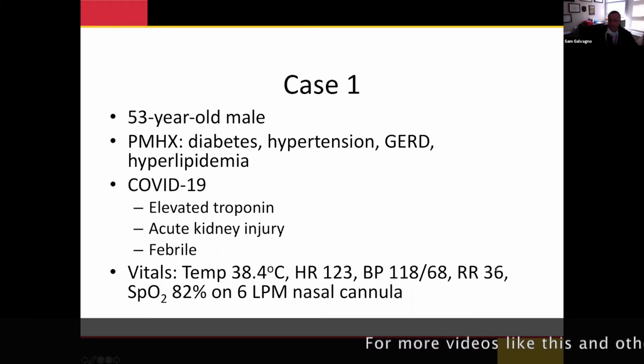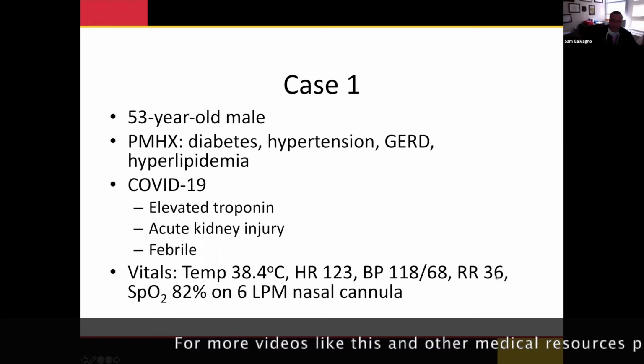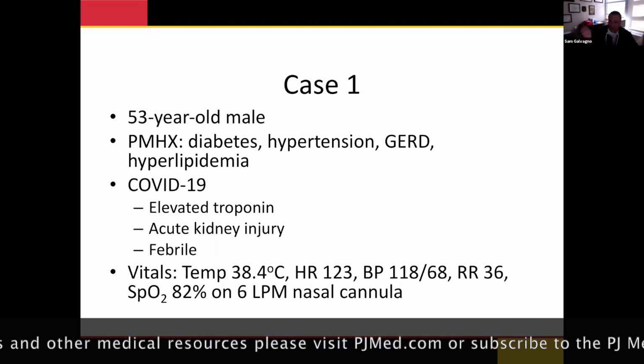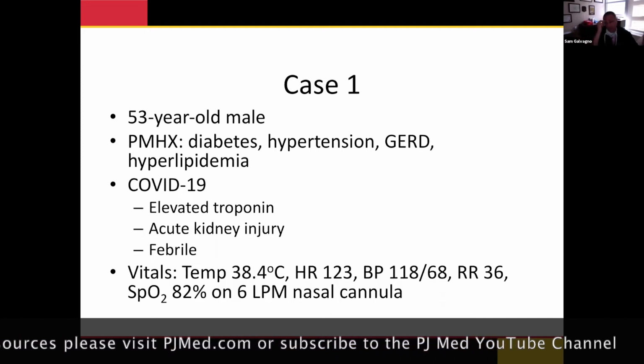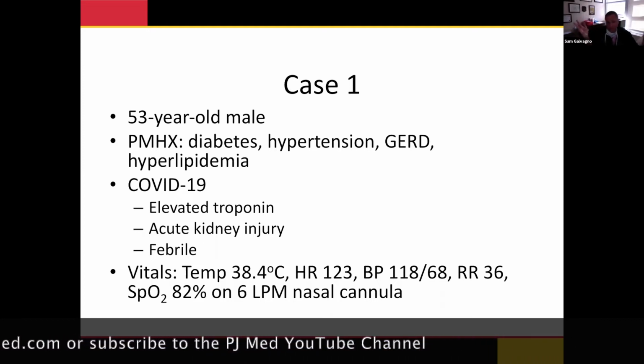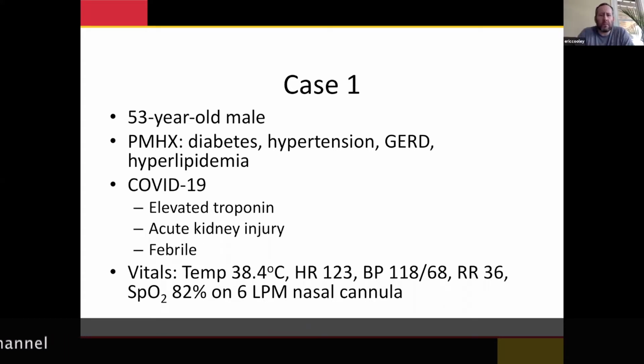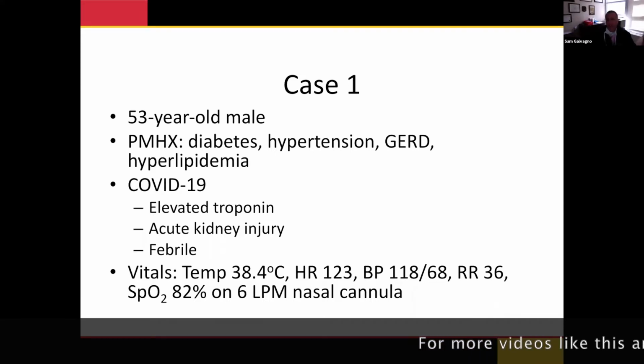And the respiratory rate of 36, I'm just getting off calls with people who are seeing respiratory rates. I just had a call with the New York guys, actually. In fact, it might be the hospital some of your guys are going to. We had a couple people on. Respiratory rates up to 60, 50. So I think we all agree that this is a patient that needs something more than 6 liters nasal cannula, right?